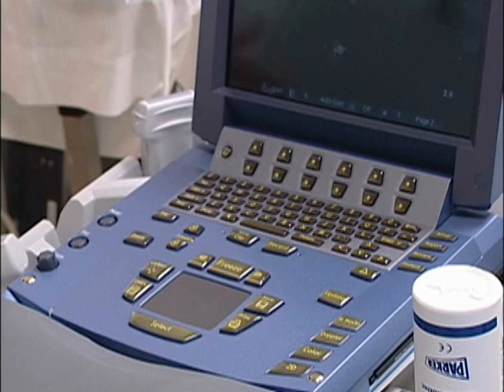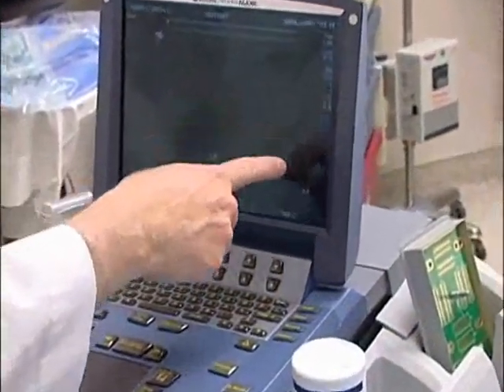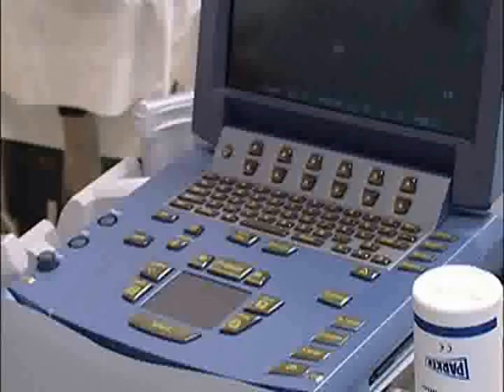Depth setting should be shallow. The subclavian vein is rarely deeper than 3 to 4 centimeters, and therefore you should only have 3 to 4 centimeters of depth showing on the machine. Depth is set with the depth buttons here. The depth of the total image is indicated on the bottom. Typically 3.8, 4.7, or 5.9 is sufficiently deep for central line insertion.